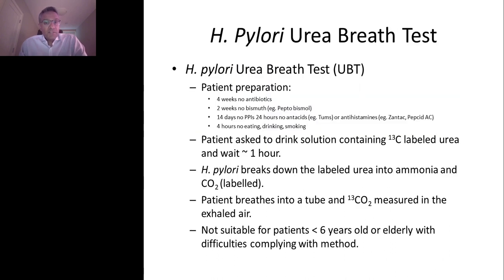Another screening test that's used that's non-invasive is the H. pylori urea breath test. For this test, patient preparation is required. Firstly, the patient cannot be on antibiotics for up to 4 weeks. No use of bismuth or Pepto-Bismol, for example, for 2 weeks. And the patient should be off of proton pump inhibitors for 14 days, and no antacids or antihistamines for 24 hours. Additionally, the patient should not have eaten, drunk, or smoked anything in the last 4 hours.